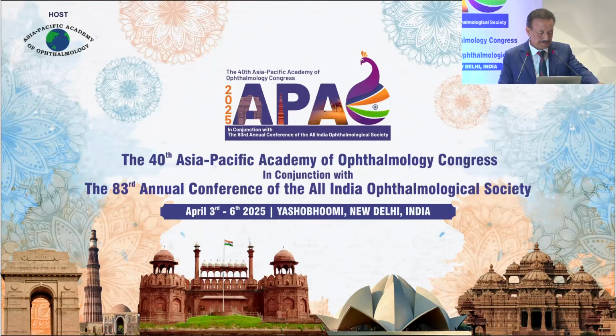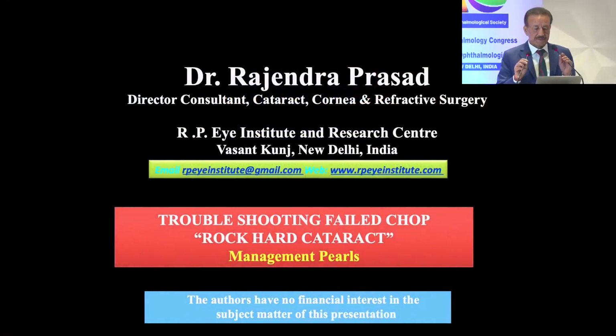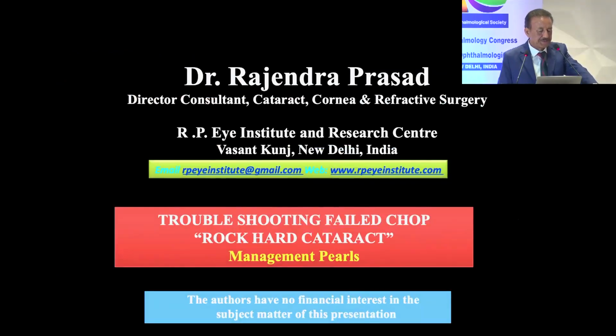Meanwhile, we can have a question to Dr. Sudhang Bharti. Dr. Bharti, do you increase the energy while you're doing femto cases? No. It's the same energy level? It is the same energy level. I don't think we need to increase that; it actually increases the turbulence. Okay. Yeah. Thank you.